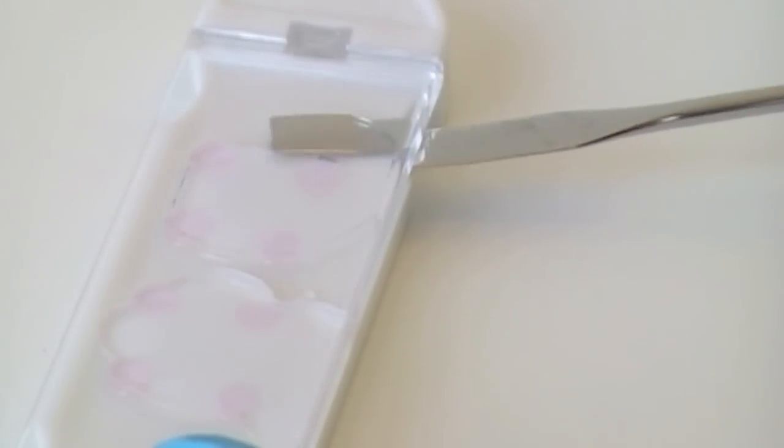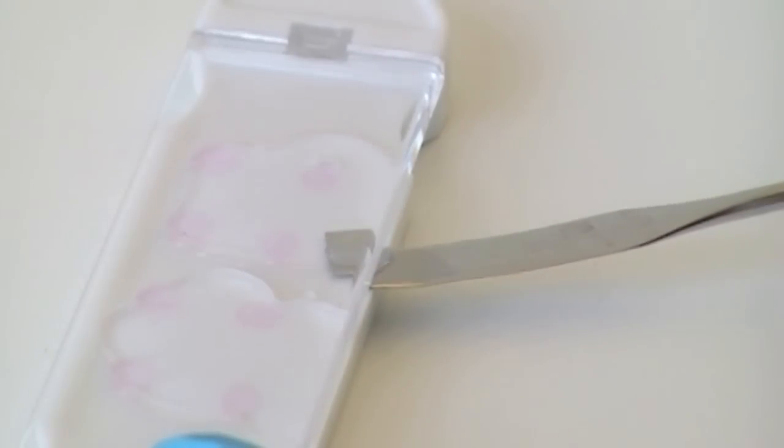Then, with a spatula, make sure to bring PBS around each and every gel disc. Every edge should be wetted to minimize gel sticking to the gel caster.